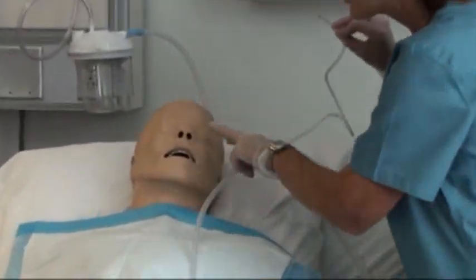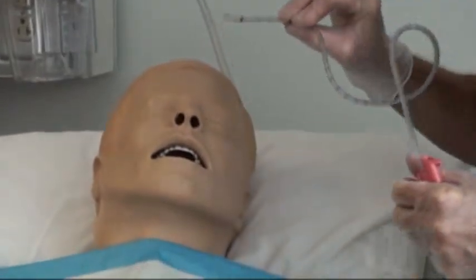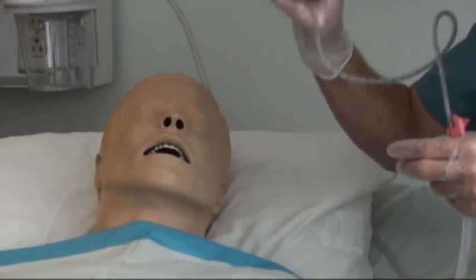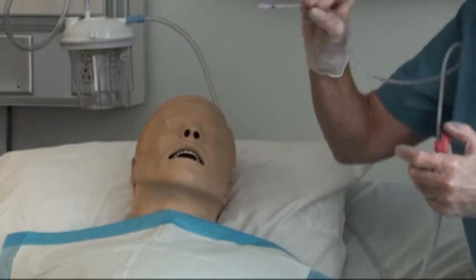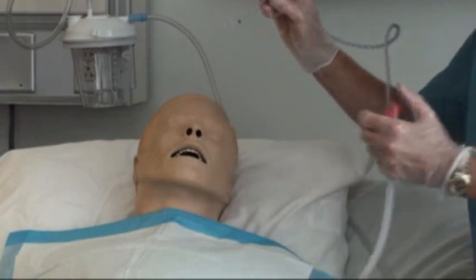Now we're going to go down — she has told me this is the better side. Once I go down, there are a couple of things that happen. I have to go in and come out within 10 seconds. I do not put suction on until I start coming out. When I start out, I do intermittent suction and I pill roll — twist this back and forth.